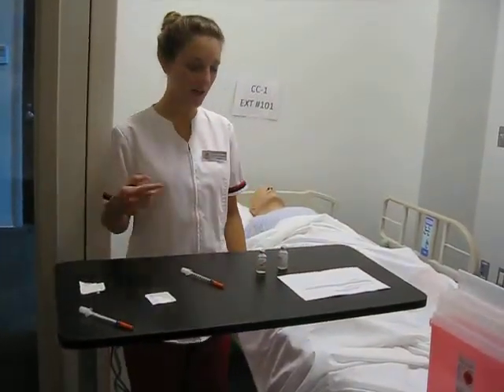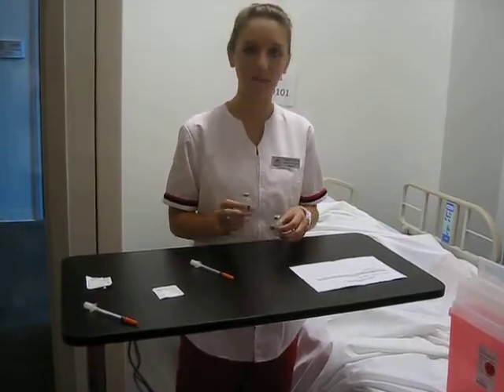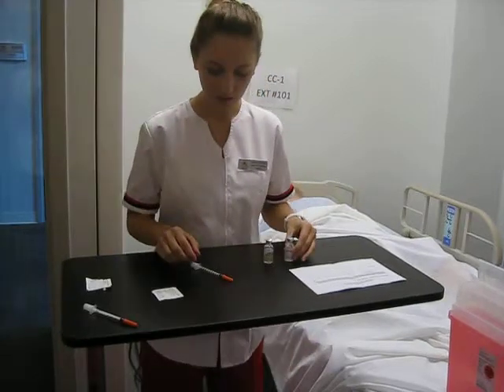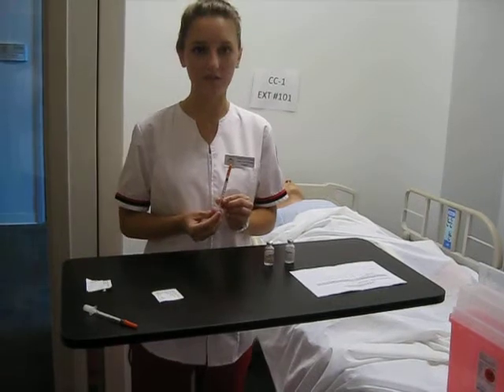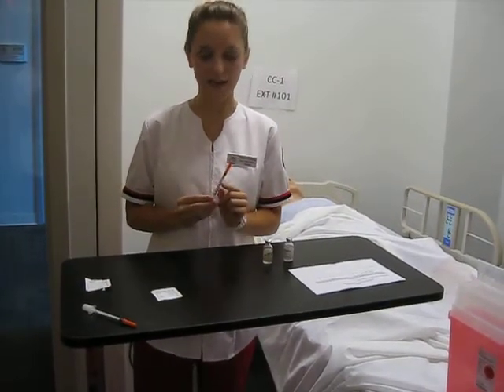I'm going to go ahead and gather my supplies. I have two vials here — one is my regular insulin and one is my NPH insulin — along with my syringe with a needle attached. This syringe is an insulin syringe. It is marked in units and my needle is attached to it.